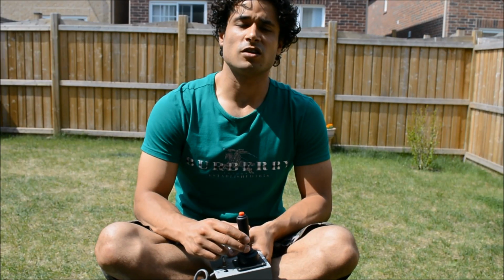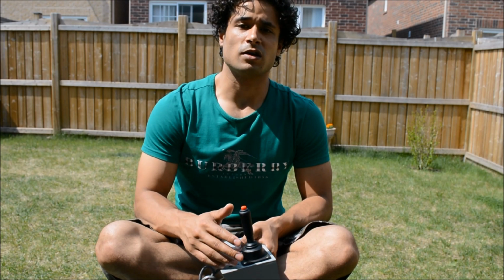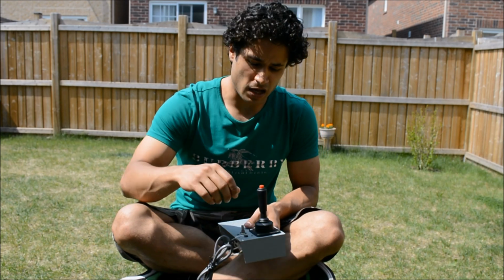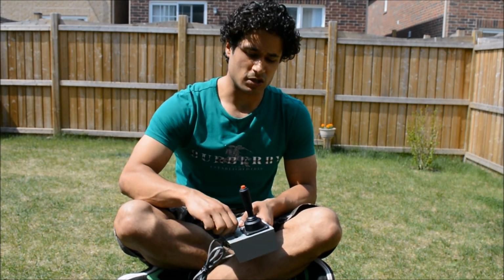Since I disconnected from the Android application, now I'm in the joystick mode. So the Android application is disabled and only the joystick will work. And I have the potentiometer to control the speed of the wheelchair through the joystick.